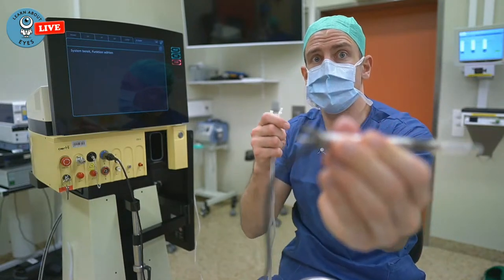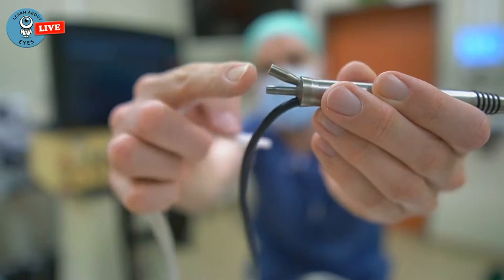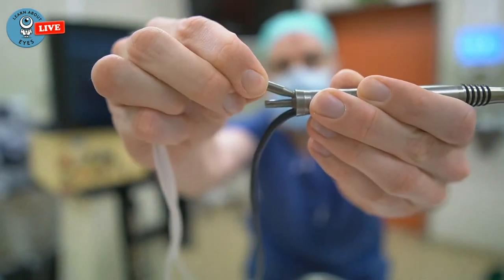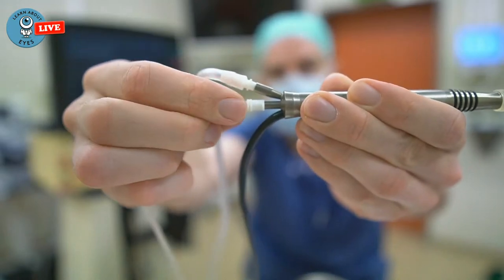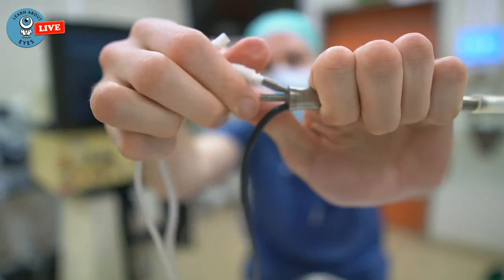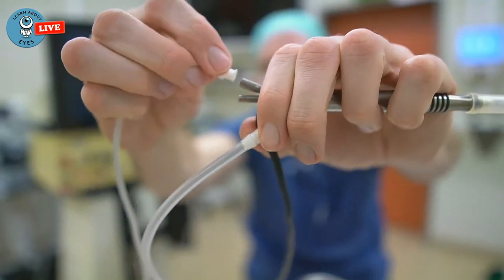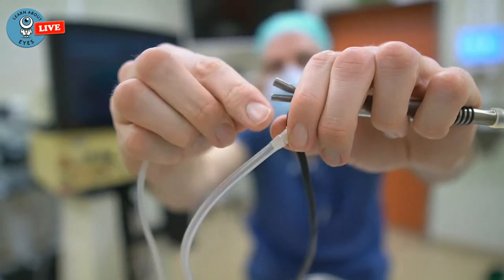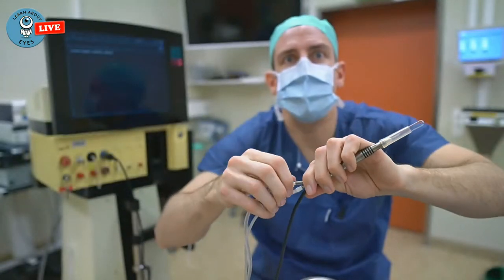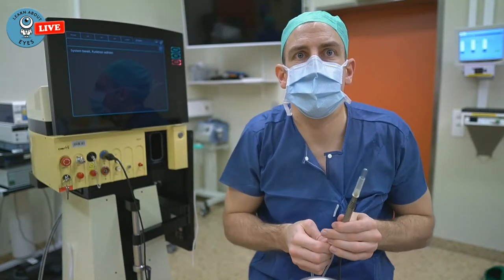So, this is the phaco handpiece. You still see it. And it has two ports. One of them goes in here, and the other one goes here. You can't actually do it wrong. Let me just show you. This doesn't work and this doesn't work, so this works, so that should be fine.